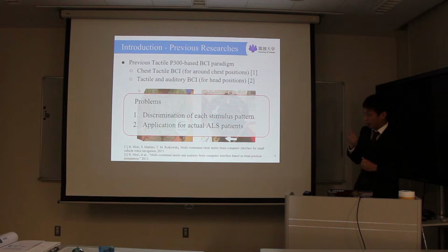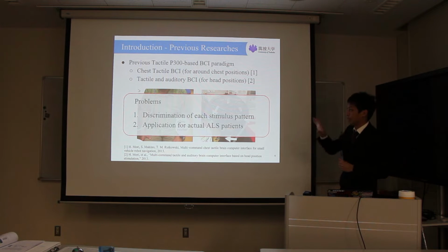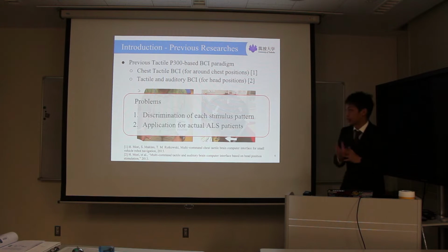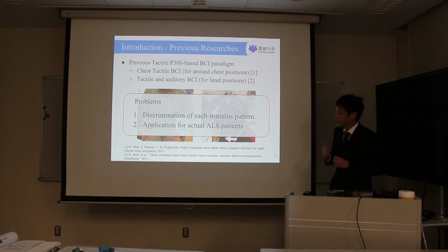However, these have some problems. One problem is the discrimination of each stimulus pattern. Since the chest and facial area is very limited, the stimulus patterns are attached to very close areas. So sometimes the BCI users find it difficult to distinguish those stimulus patterns.